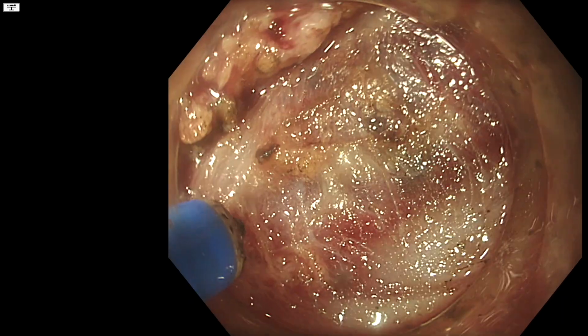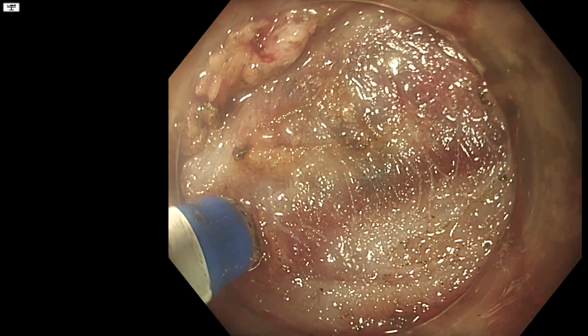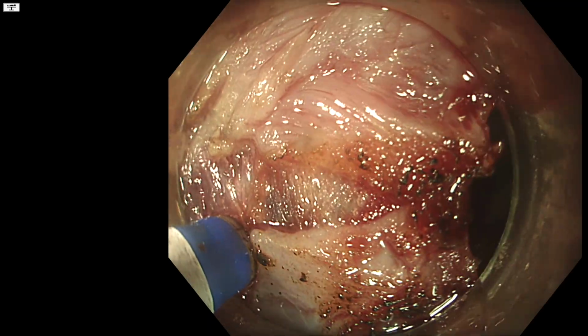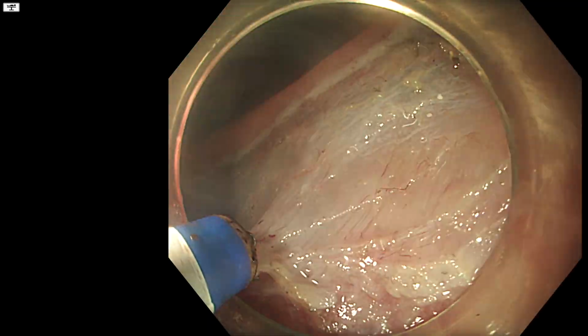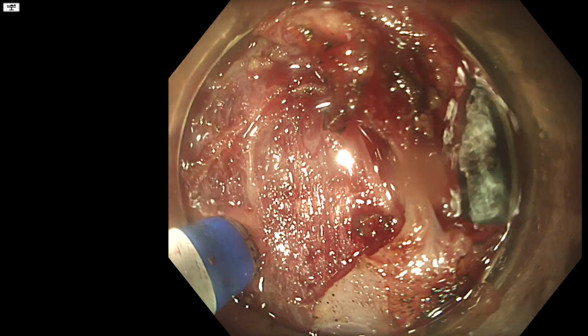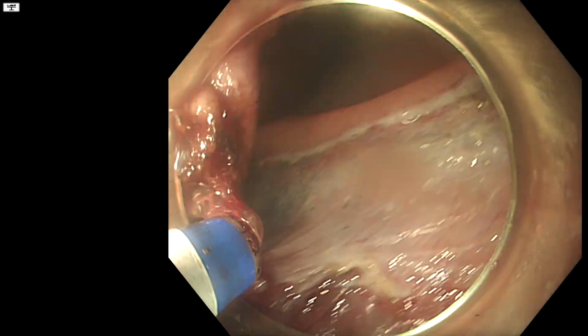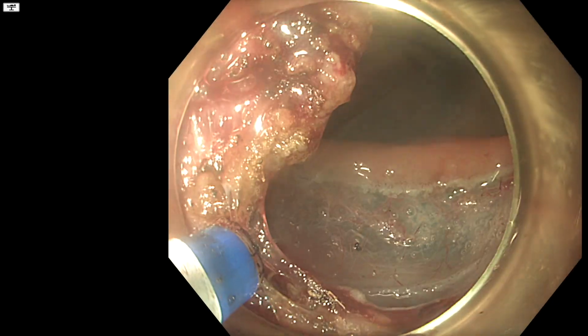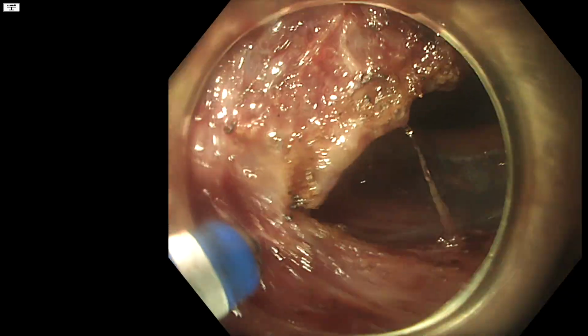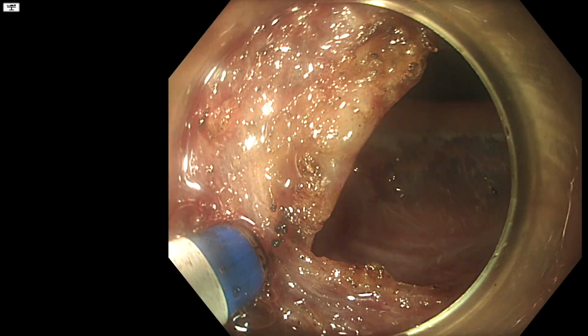Okay, so we're now at the final stage of the procedure. As you can see, the traction is quite literally doing all the heavy lifting here. It's pulling the tissue away cleanly and giving us excellent exposure of the resection bed. So we switch to coagulation mode at a higher wattage here to seal any small vessels and prevent any residual bleeding as we complete the disconnection.